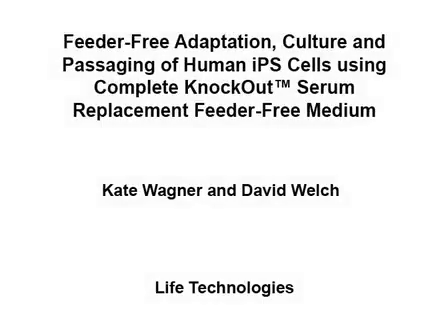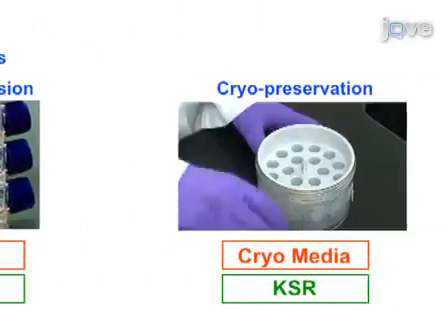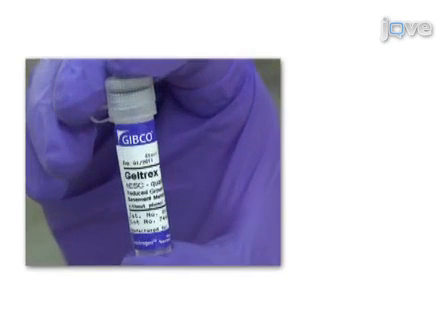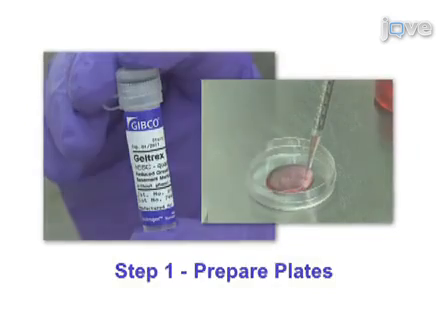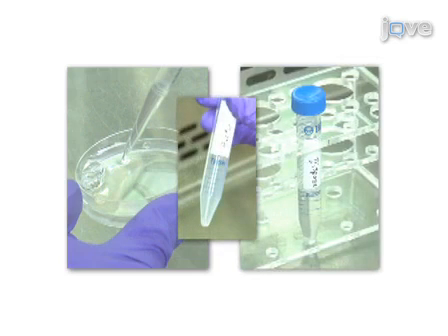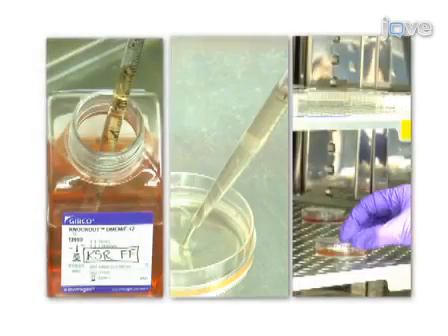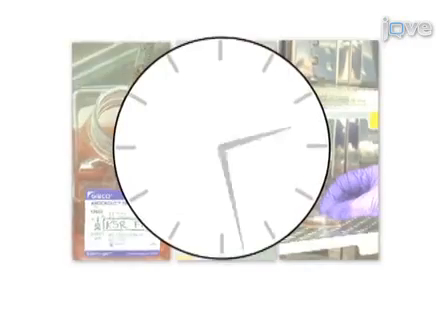The overall goal of this procedure is to adapt and maintain human-induced pluripotent stem cells to feeder-free culture using complete KnockOut Serum Replacement Feeder-Free medium. This is accomplished by first preparing Geltrex-coated or CellStart-coated plates. The second step of the procedure is to passage your iPS from MEFs to feeder-free medium using Dispase. The final step of the procedure is to continually maintain your iPS cells feeder-free.